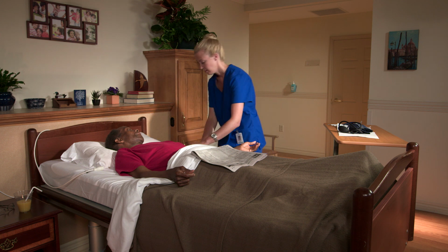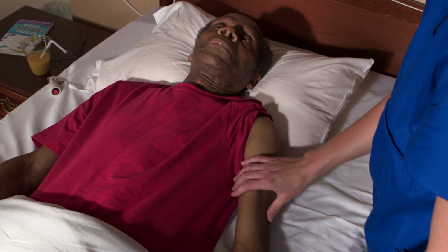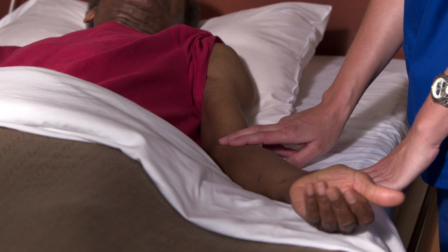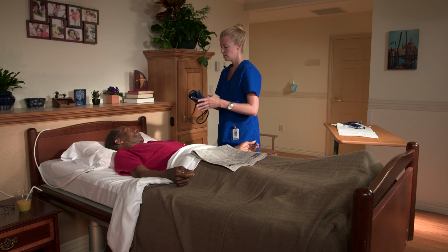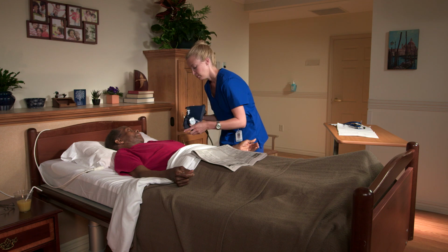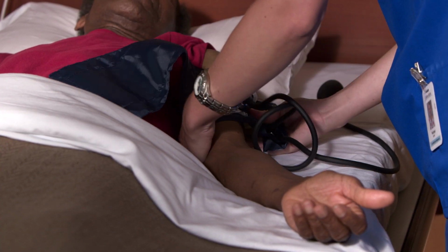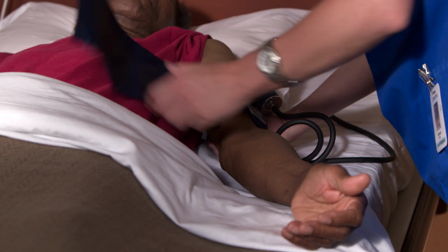Okay. Now I'm going to put your sleeve up here for you. Adjust the person's clothing as necessary to expose the upper arm. Locate the person's brachial pulse on the inside of the elbow. Place the cuff on the person's arm over bare skin with the arrow directly over the brachial artery. The bottom edge of the cuff should be about 1 inch above the person's elbow.